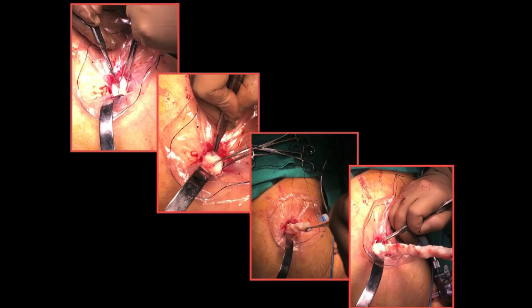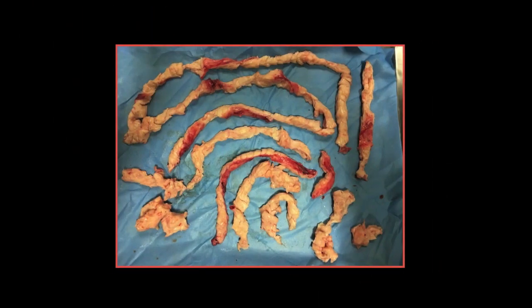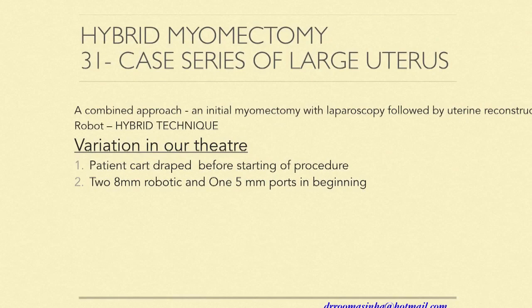For morcellation, we put the specimen in a bag, bring it to the umbilical level, and perform cold knife morcellation. The strips come out almost as if you had done an electrosurgical morcellation. We avoid an electromorcellator due to the concerns and cost associated with it.